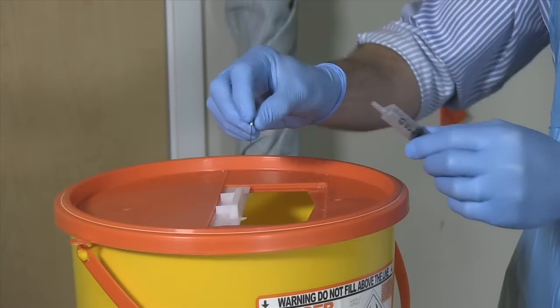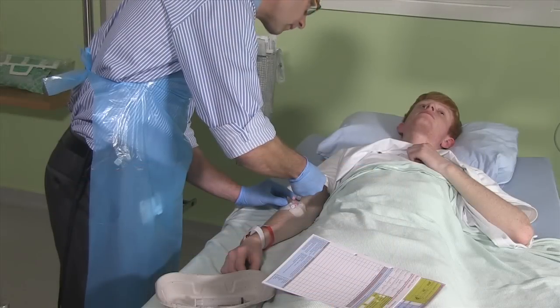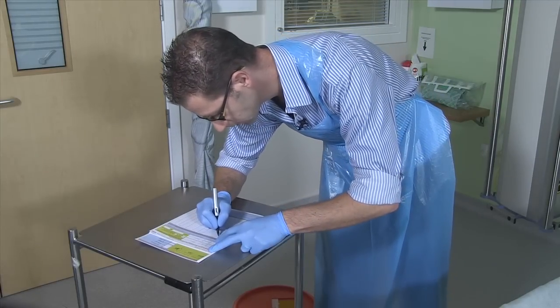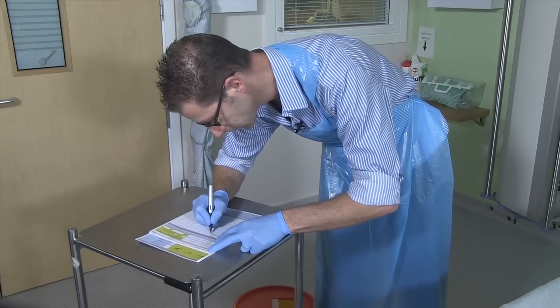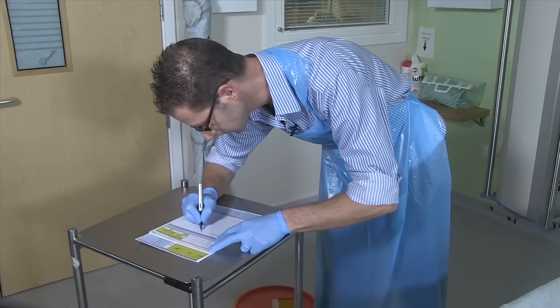Discard the needle and syringe in the sharps bin and flush the line again with five mils of saline. Remember to prescribe and sign for the drug on the drug chart. Good practice would also be to write it in the notes. Put the time the drug was given in these entries as well.